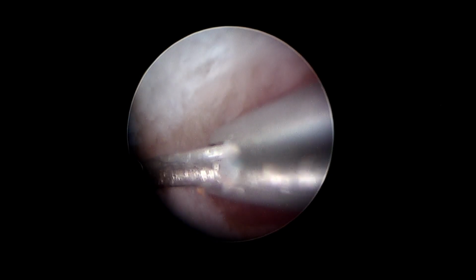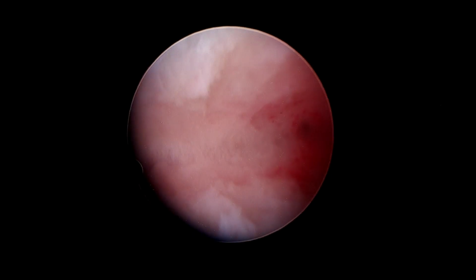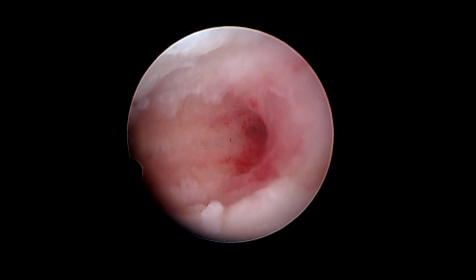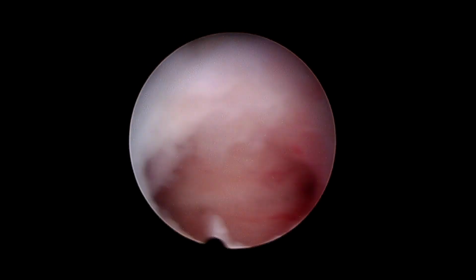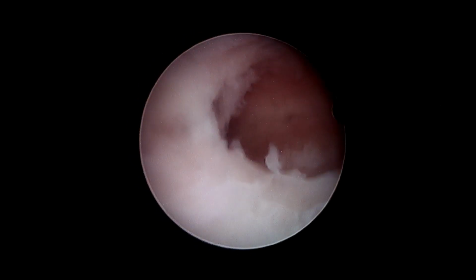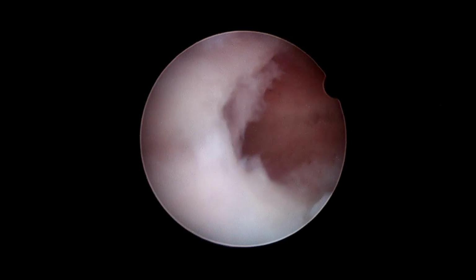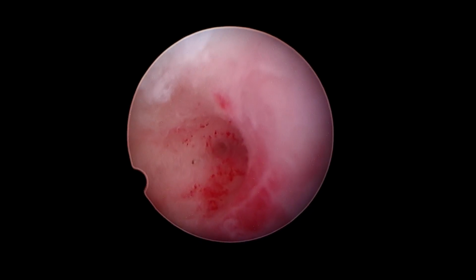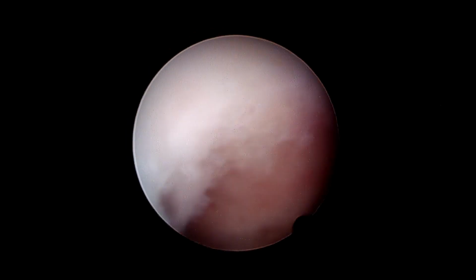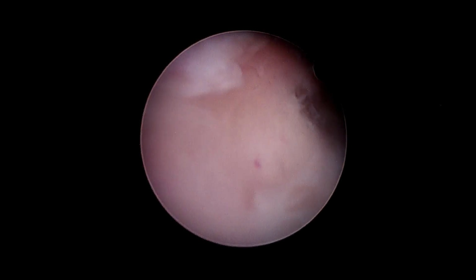This is the last portion of the adhesion, which will be taken care of with the help of scissors. The only problem when you do adhesiolysis with scissors, and as you notice we give a lot of pressure in the uterine cavity, is that the scar that is causing the adhesion is going to be there even though you have incised it. So what I follow is to excise the scar, which I'm going to show you later on.